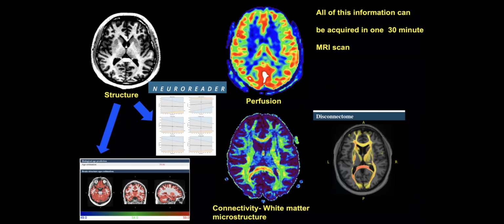This is readily available. And again, having this measurable or quantitative imaging also adds a lot more information that qualitative or visual assessments simply can't provide. And what you'll also notice is that each of these techniques is complementary, providing convergent validity of abnormalities by looking at different domains of the brain, whether it's the physical structure of the brain, the physiology of the brain with perfusion, and the underlying connectivity of the brain, which we know is particularly vulnerable to traumatic brain injury.